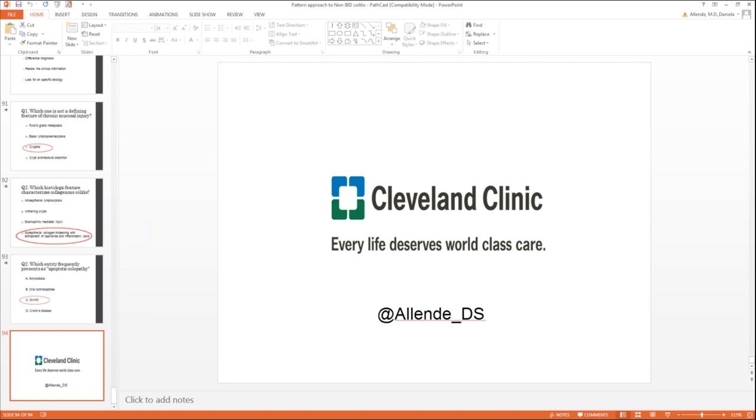I pointed out how cases of ischemia, for example, in the regenerative phase can look very worrisome. So I think the features that we look for are very specific to the organ, because if I'm thinking of pancreas, regenerative or atypical changes in the setting of reactive versus dysplasia are very different from the colon. But looking at the colon, the things that we look for is, first, in that case that I showed you with ischemia, I knew that the patient had ischemia in the background. Many times it's IBD in the background, and we have regenerative changes in that setting. So we know that the background has a certain level of injury or inflammation.